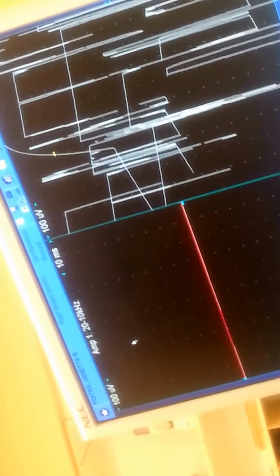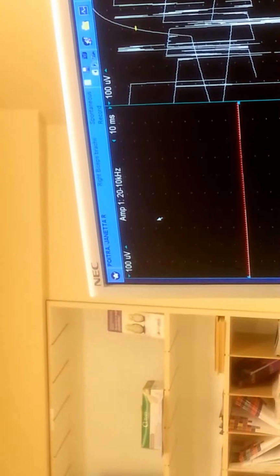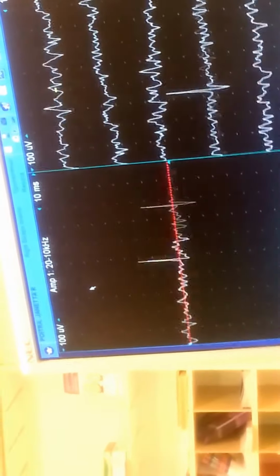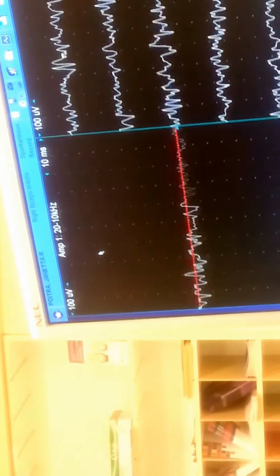So that's from the 5th cervical nerve root. That's the deltoid muscle. Now we're going to do another C5 and C6. C5 and C6 means 5th and 6th cervical nerve root. So the electricity coming from your spinal cord to these different areas of your arm. All right, here's a poke. Hang in there. Be out of there soon.